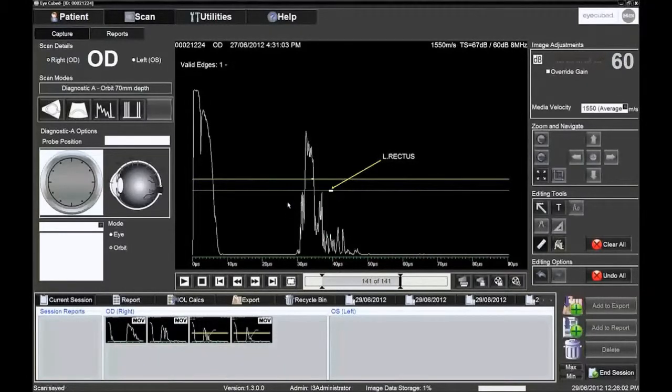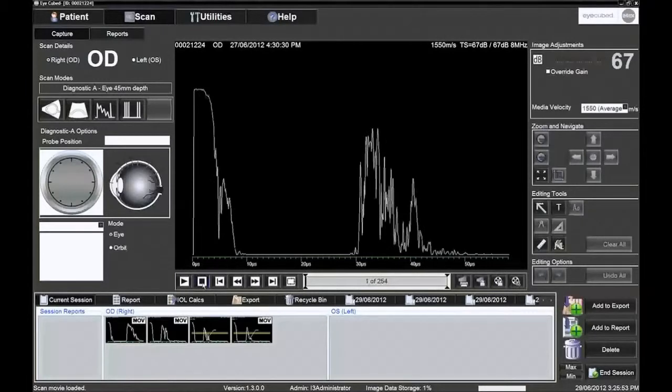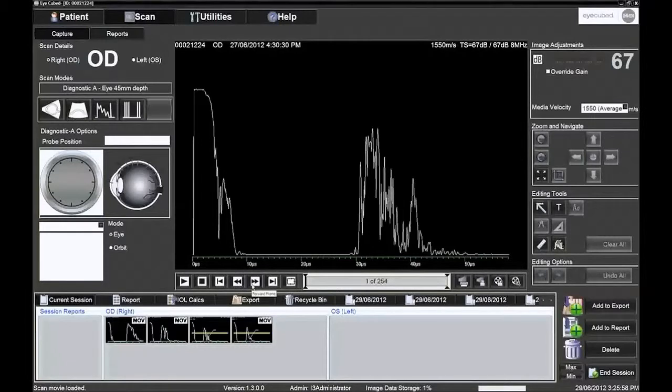The icons on the lower left of the screen control how to play the movie. Hovering the cursor over each icon displays each of their functions.